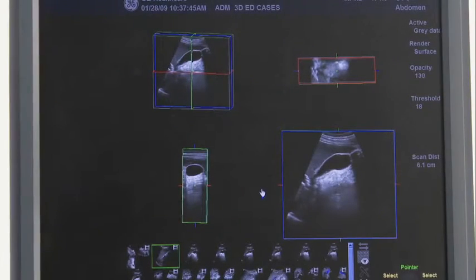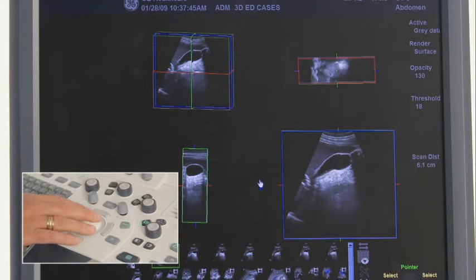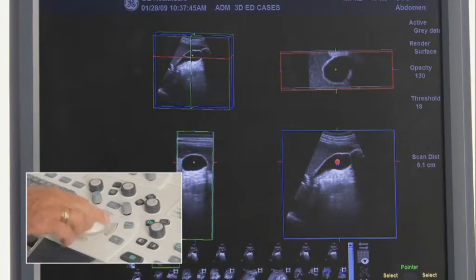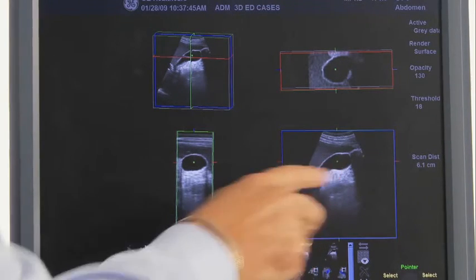While in Group Planes Main, you can also use the Z technique to visualize the coronal plane of any organ. Use the red hand and the right trackball key to parallel shift. Roll your trackball through the dataset to find the anatomy of interest. Then select the right trackball key again to release the hand. Place the tip of the finger in the anatomy of interest, for example, endometrial stripe or gallbladder. Then double-click on the right trackball key. This moves the axis dot to the anatomy of interest.